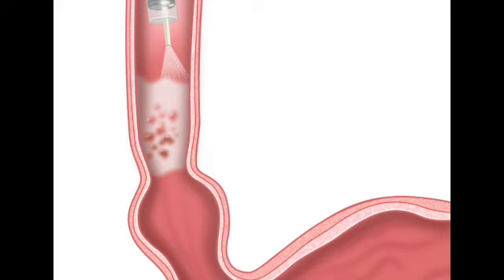But the source material details a highly specific, tense scenario regarding what happens after one of these flat polyps is removed. Oh, right, because if the polyp is flat and camouflaged, how do you know you actually scraped all of it off? Exactly. It's not like chopping down a tree where you clearly see the stump left behind. You've hit on the exact anxiety surgeons face in that moment.